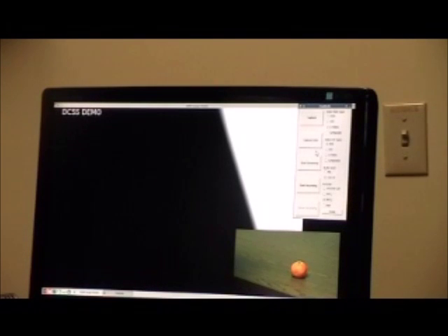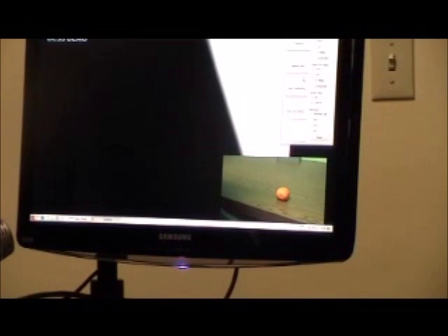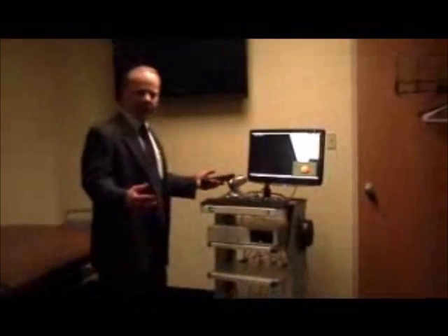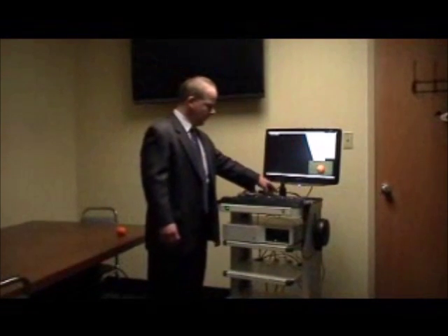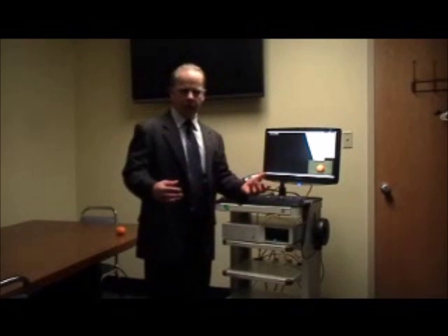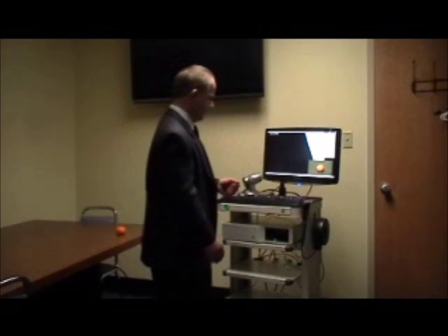be able to either have a wider out view to show the interaction of the caregiver with the patient, or in a lot of cases you might just want to get it closer to the patient's body to provide a good reference point for where you might start using the more detailed closer in camera. So you can think of this one controllable camera here as being sort of the 3 to 6 inch range view for an area of the patient's body, for instance, so you know whether you're on the upper part of an arm, a lower part, an elbow, different other areas.